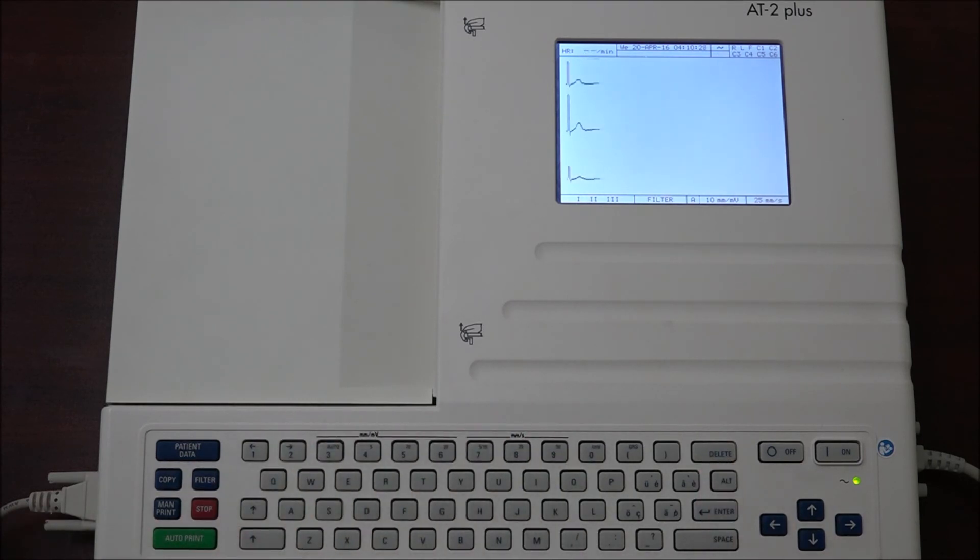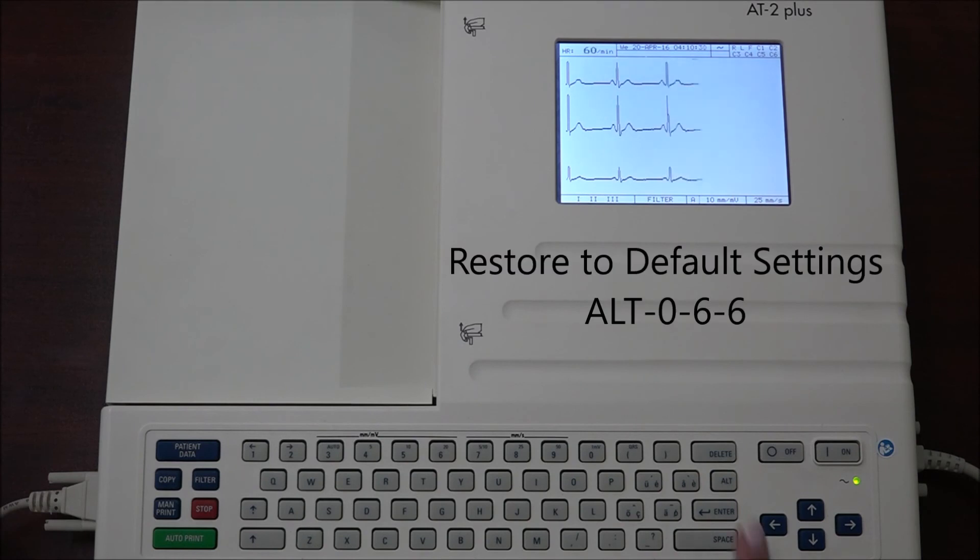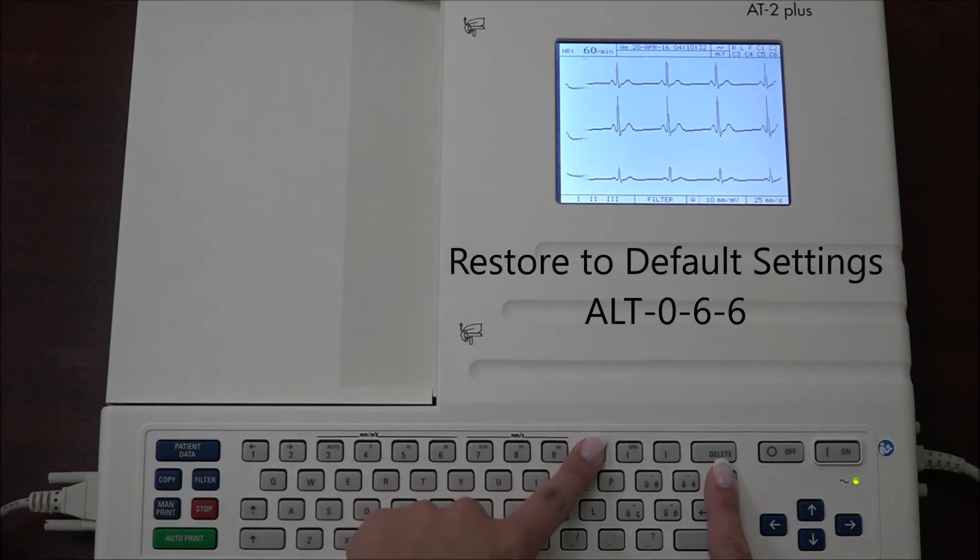To reset the settings to the default settings, press the ALT key followed by 0 6 6.